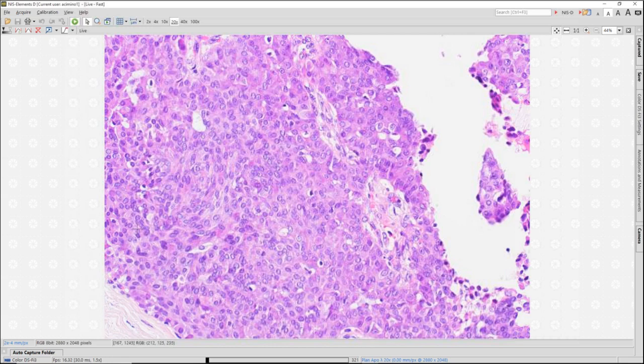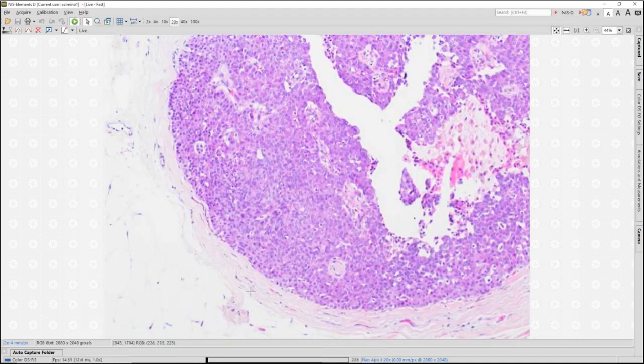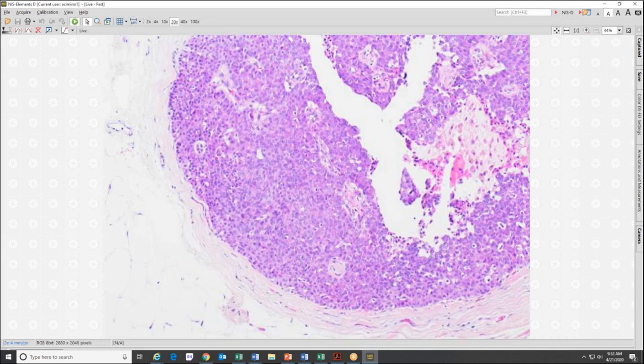It's streaming in areas, which resembles usual, but then some of the cells show some granularity, this pink granularity, which makes me think, could it be showing some neuroendocrine-like differentiation? That's a feature we see in solid papillary carcinoma and in some solid papillary DCIS cases. So I'm seeing mixed streaming and granularity to the cytoplasm, and this variability between the granular darker pink cells and the lighter pink cells. There's some suggestion of necrosis, so I want to work this lesion up further.